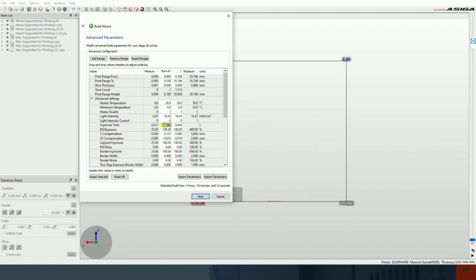So again, when you're printing, it's a dynamic experience, right? It's pressing into this viscous liquid. It's pulling out of this viscous liquid. If you have a larger printer, it's going to create a vacuum almost, like when you're trying to pull something out of a viscous liquid. So you can adjust your lift rate, your acceleration rate, deceleration rate, all of these little things to really tweak your print so you get optimal prints. You don't have to. That's the nice thing, because you have all those validated resin profiles. All the manufacturers and Asiga, they've done the hard work for you already, and their profiles are pretty optimized.